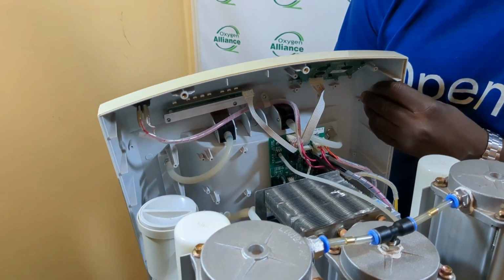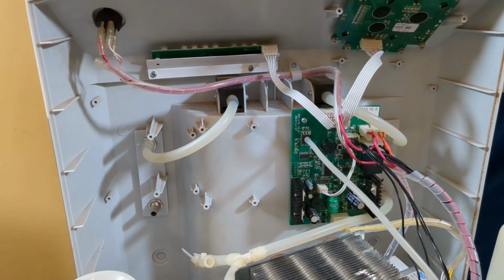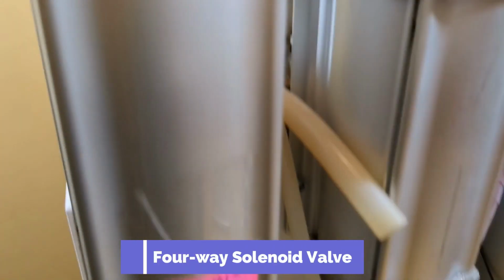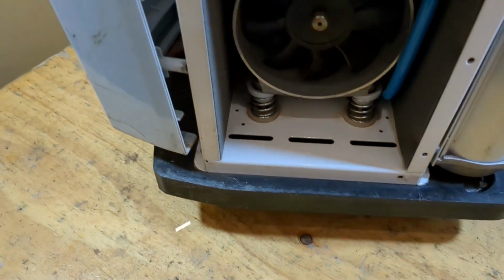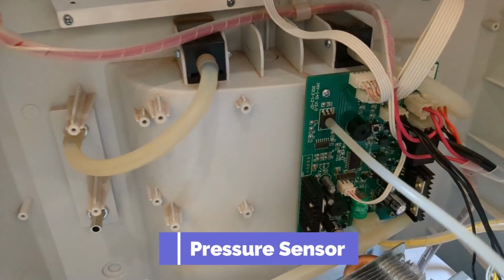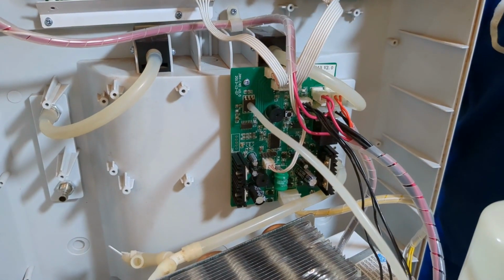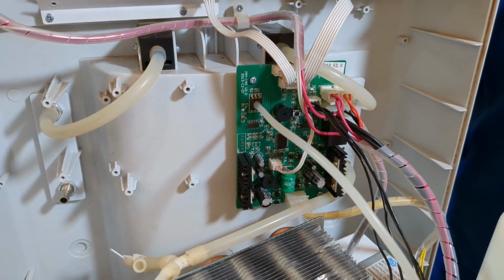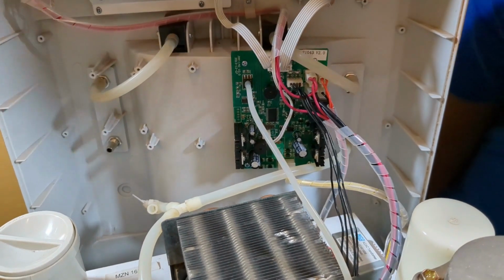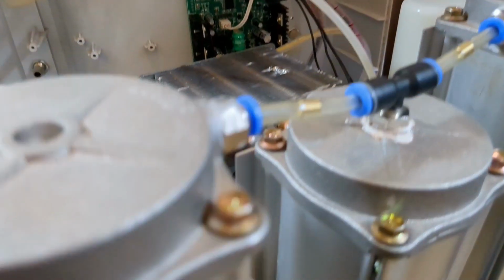So this is our main control board, and it is responsible for controlling the electrical components of this machine, such as the four-way valve. We also have the compressor. We have the pressure sensor, which measures the feeding pressures in the four-way valve. In some models of these oxygen concentrators, we have an oxygen sensor, and this is also controlled by the main control board. So for a better understanding of how power gets to the board, let's move to the power socket of the oxygen concentrator.